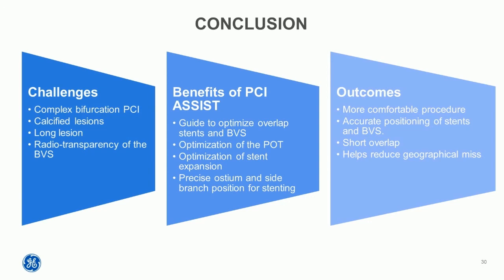And of course, it is very useful when we use BVS with these very radio-transparent devices. So in our daily practice, it is more comfortable for us to have this kind of tool to do complex cases.